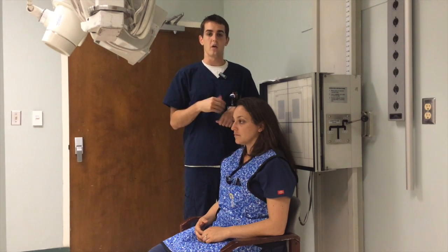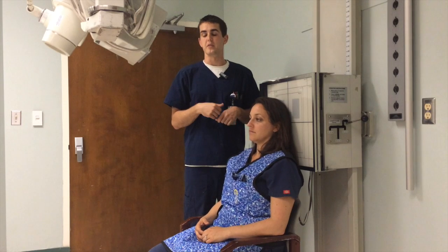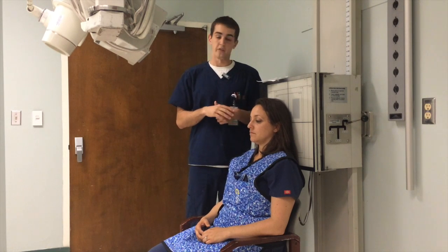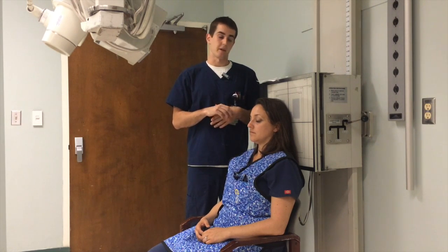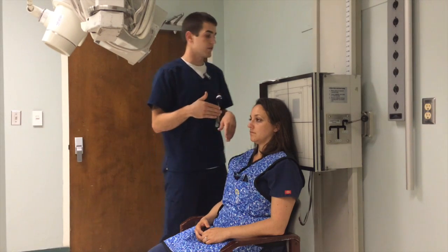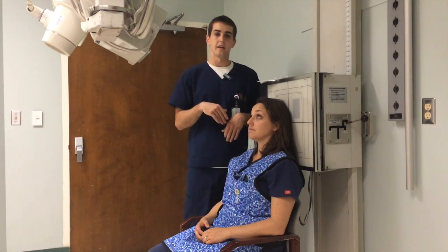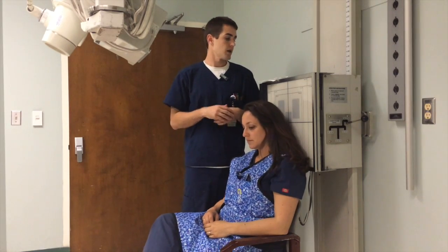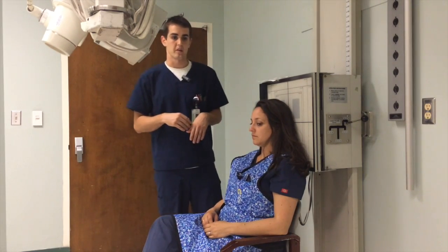If we couldn't get the OML perpendicular, then we would do the IOML and tilt the tube at 37 degrees caudal. But we're going to be able to do the 30-degree caudal because we're going to get the OML perpendicular. We want the mid-sagittal plane perpendicular to the IR as well, and we want the central ray to enter 1 inch above the nasion, so around the glabella.